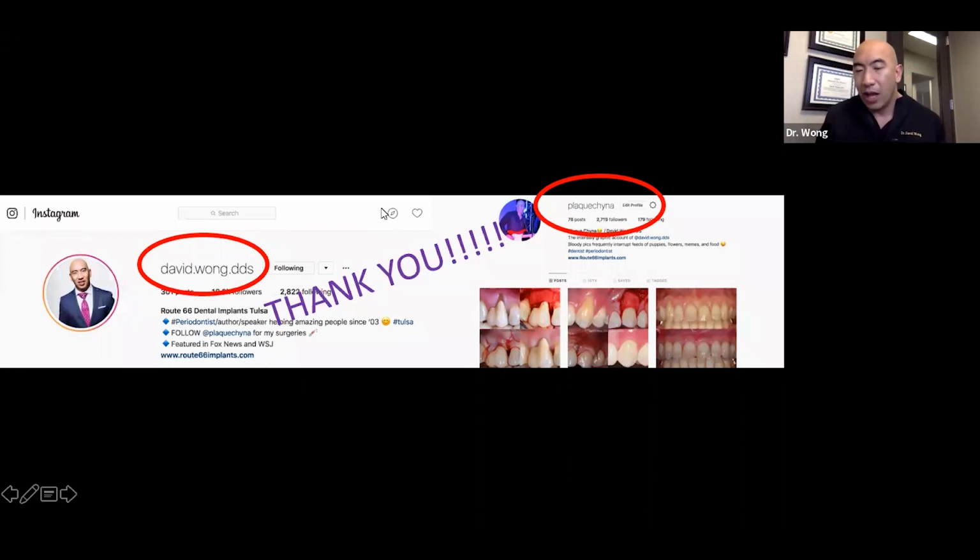And if you want to do that, that's totally fine. It actually does have some benefits because you'll get some soft tissue healing and coverage over that by then. So that's one good way to do it. I usually just graft it anyway, just because I'm trying to minimize patient appointments. Just being a specialist, they don't want to come here that often. So that's just me. But the safe bet is to stage it if you're so inclined to do that.